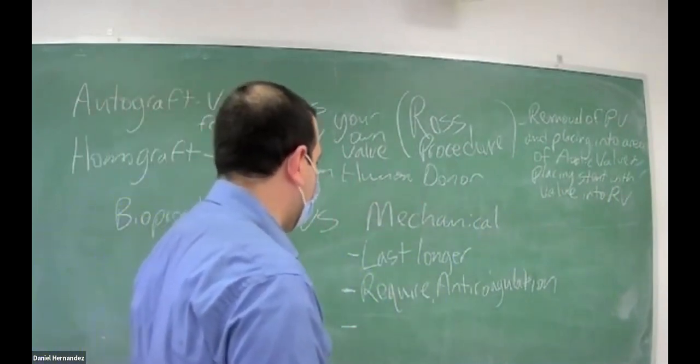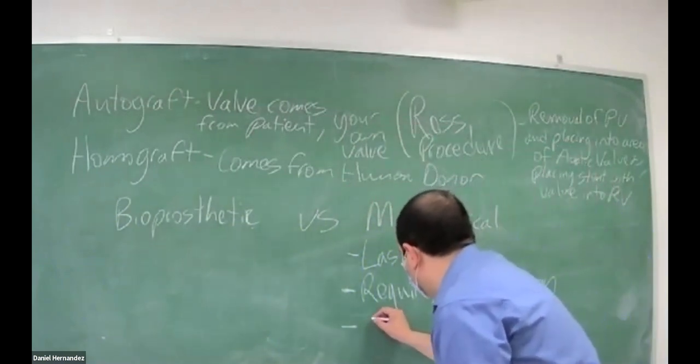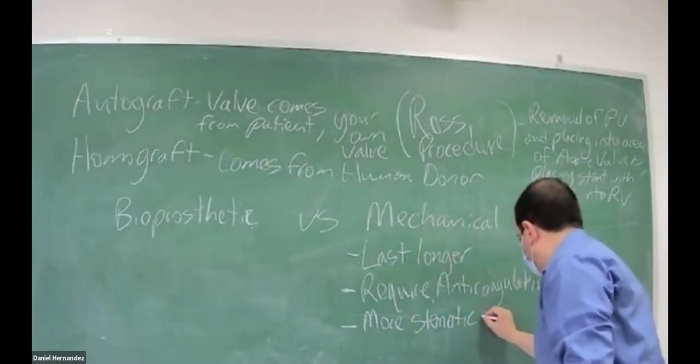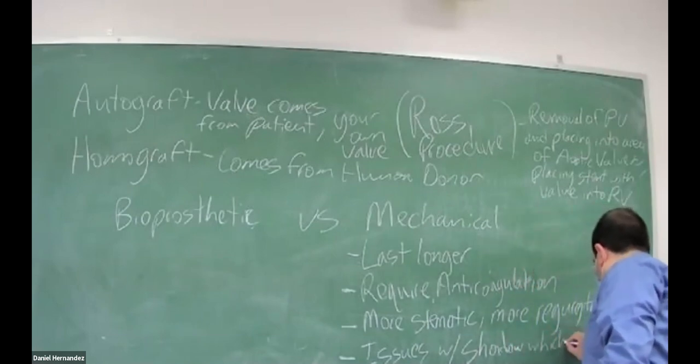Some disadvantages also: more stenotic, more regurgitant, exactly. Issues with shadowing, which limits assessment.